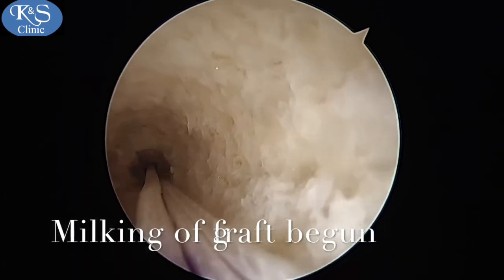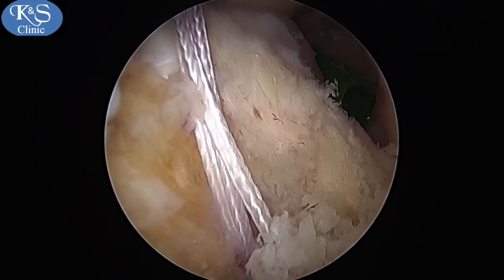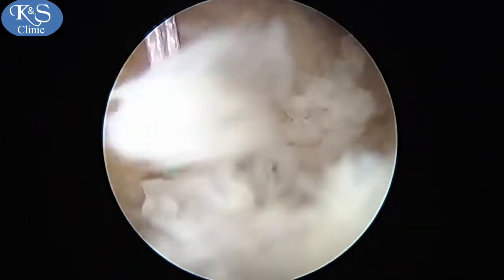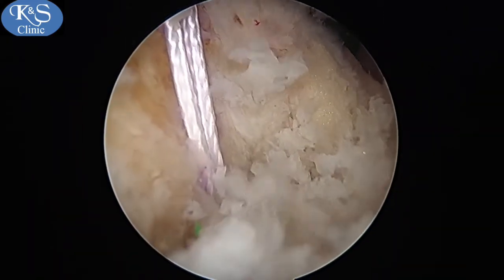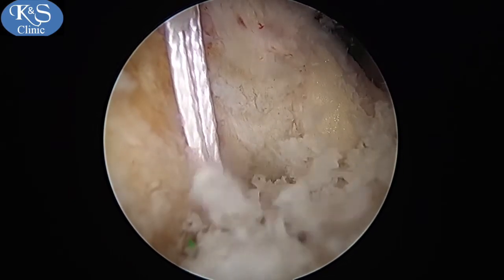You can now see it flip. Once flipped, the milking process starts, pulling the graft up through the tibial tunnel into the femoral tunnel. You can now see the graft being milked up when viewed from the posterolateral portal.